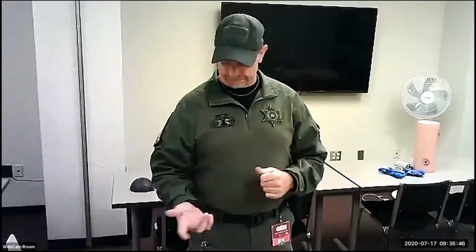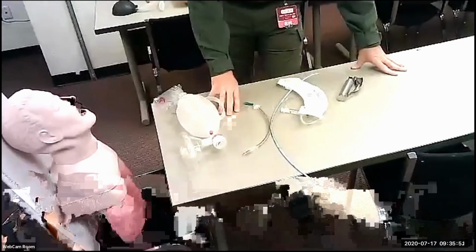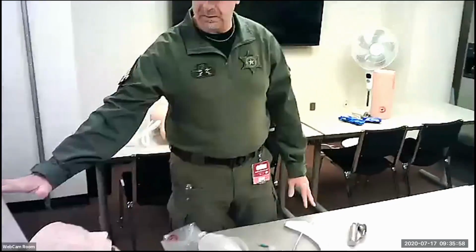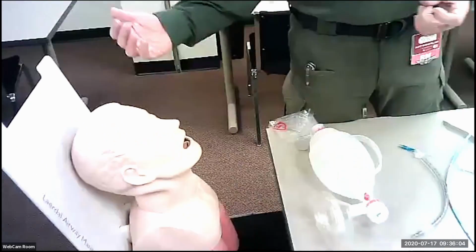They don't teach us this in anesthesiology. They don't teach us anywhere else. It's just a technique that we've learned pre-hospital wise. All right, so basically what this right here is going to simulate is the hood of the car, or whatever else. It could be in a collapsed building. It could be somewhere that I can't get to the victim. You see the victim over here? Let's just simulate that they're still strapped in their car seat. I cannot get to them because literally they're entrapped.